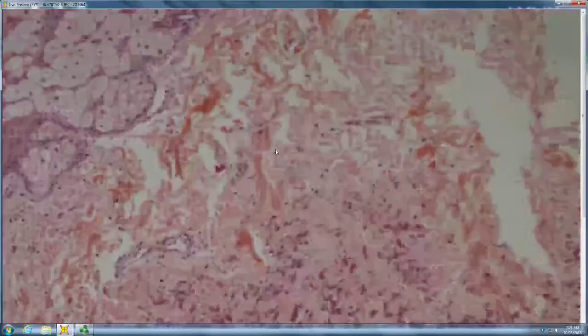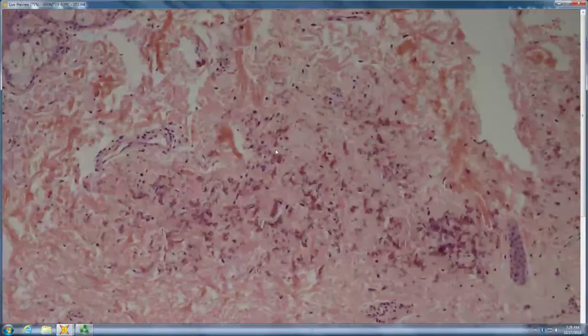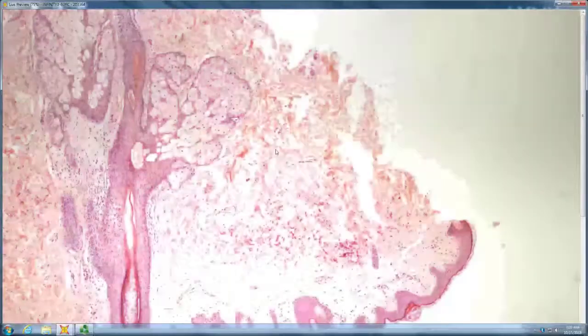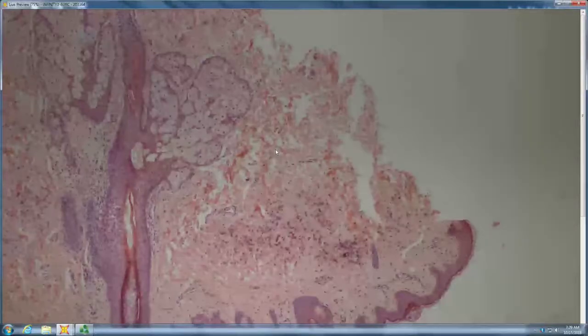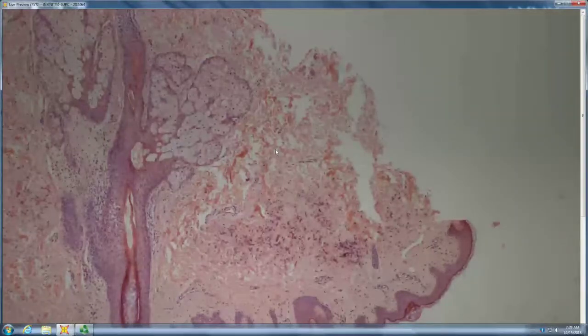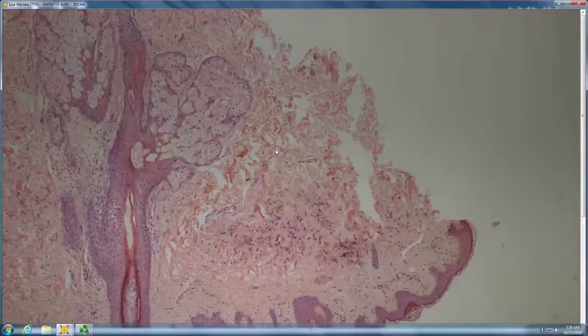It's like PXE. Looks like pseudoxanthoma elasticum. So in what way does it look like PXE? It has those crinkled elastic fibers. Like little crinkled calcified elastic fibers. In Singapore, they refer to it as chicken floss because it looks like the chicken floss they put on eggs and eggplant and other things.